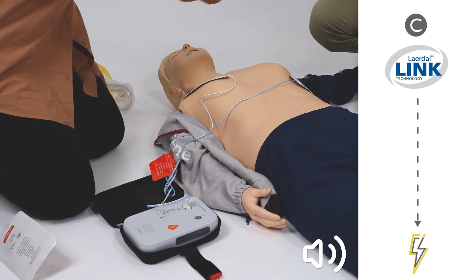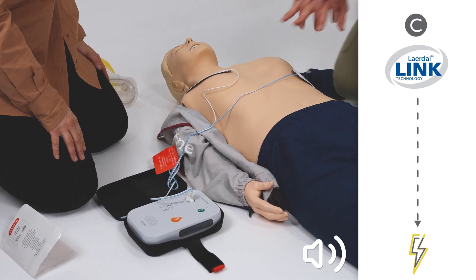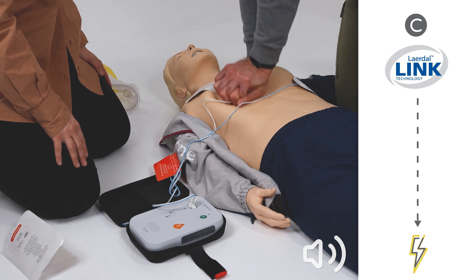Shock advised. Shock delivered. Begin CPR. It is safe to touch the patient.